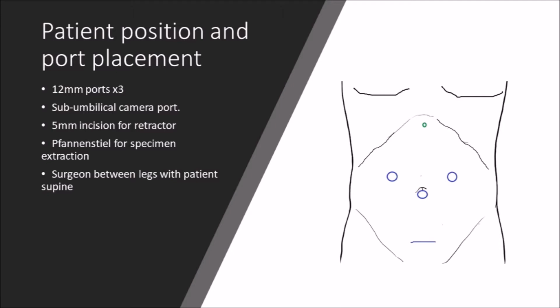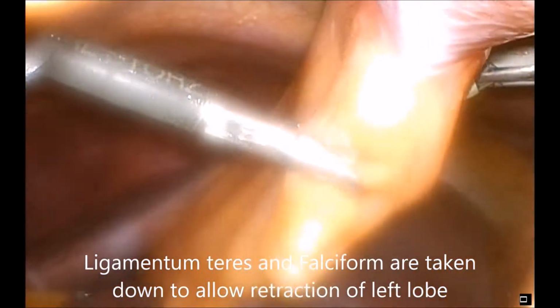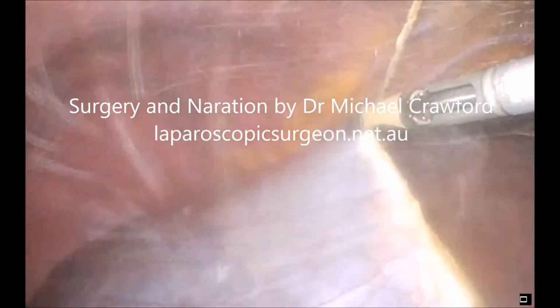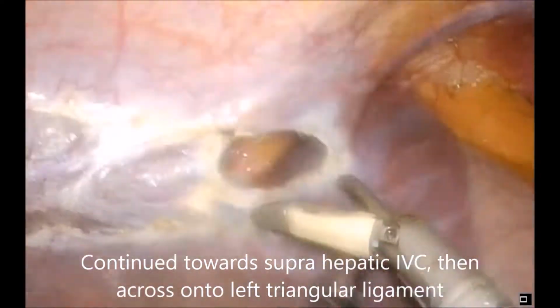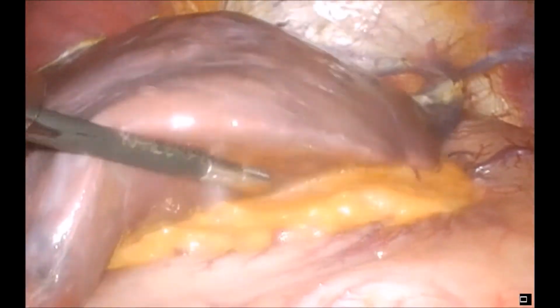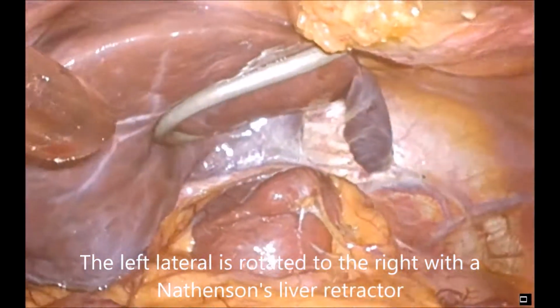Laparoscopy was achieved through a periumbilical port. 2 other 12mm ports were used, and a subxiphisternal incision was made for a liver retractor. The operation starts by taking down the ligamentum teres and continuing along to take down the falciform ligament in order to be able to retract the left lobe of the liver. The left triangular ligament here is taken down, and this dissection is continued up towards the inferior vena cava until the liver is mobile enough to place a Nathanson liver retractor.